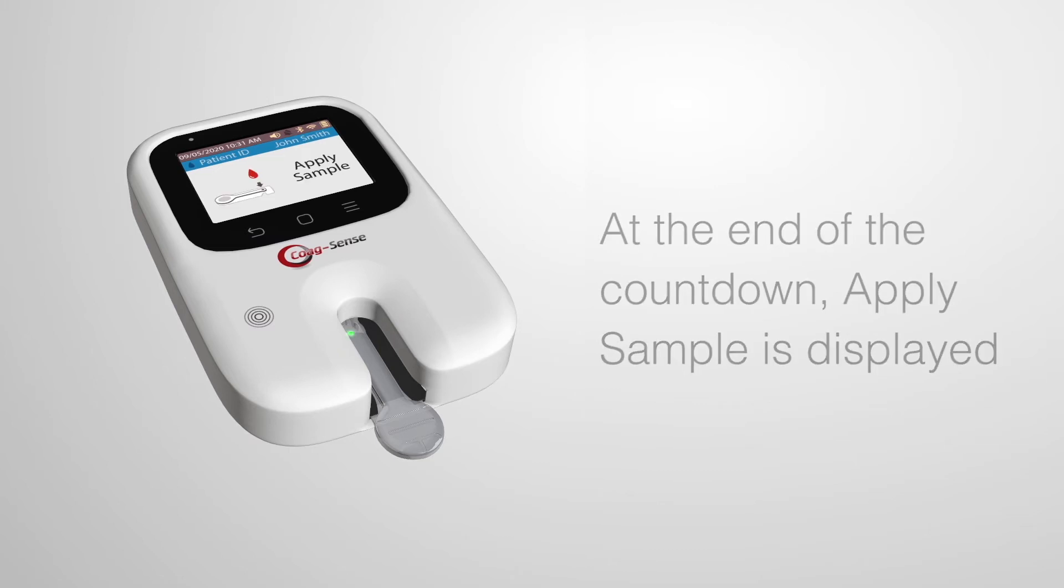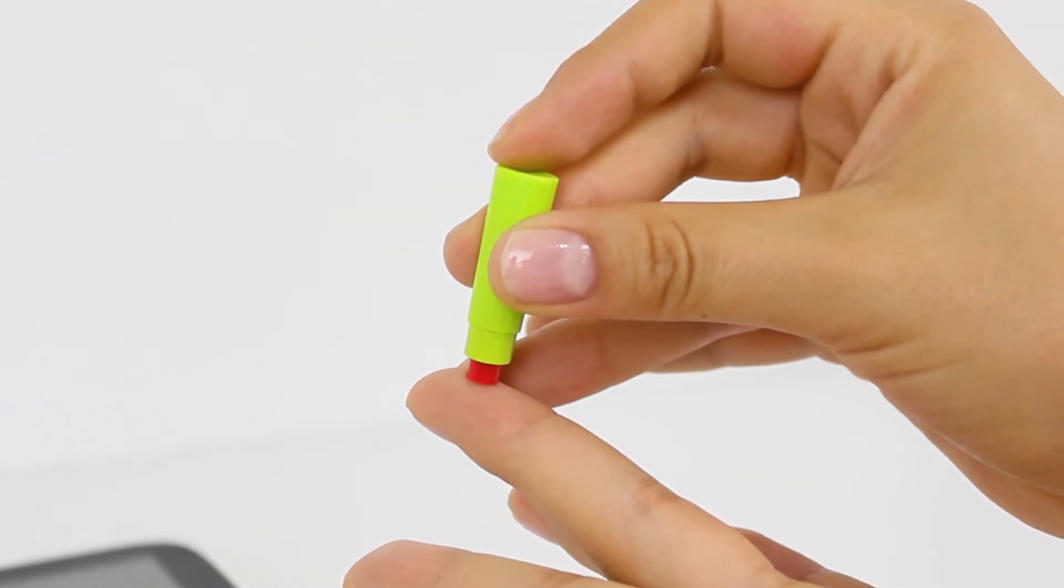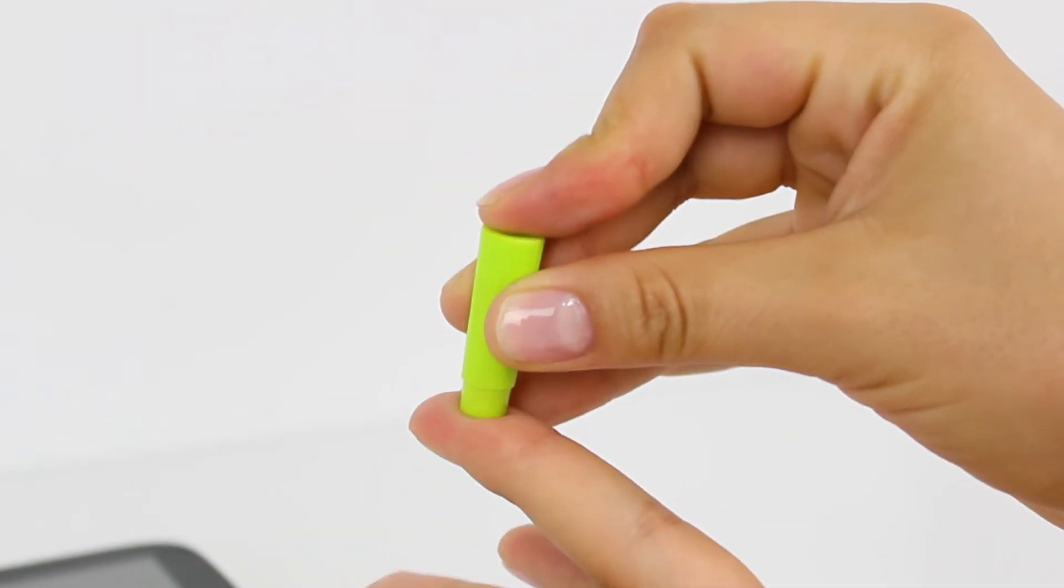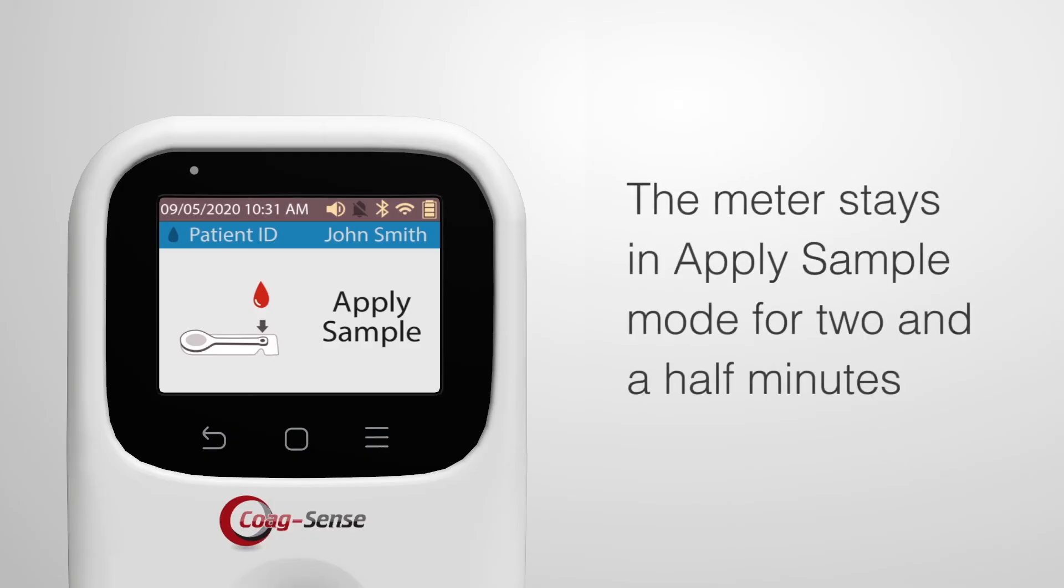A green light will start blinking in the sample well. Press down hard on the finger with your lancet and lance your finger according to the instructions provided by your lancet manufacturer. Note the meter stays in apply sample mode for two and a half minutes.